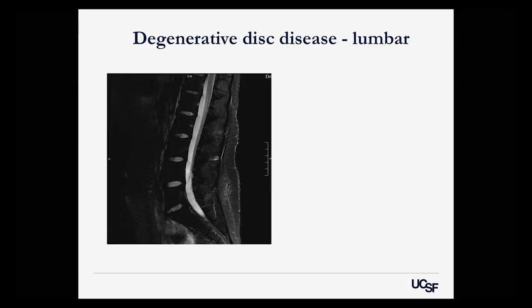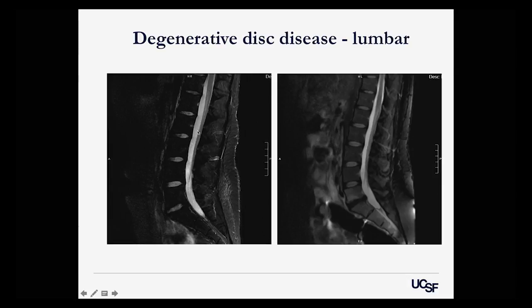This is an MRI scan that demonstrates some of the structures that Dr. Shah showed us. This is a sagittal MRI scan, so looking at a patient from the side, these are the discs. The bright coloration means that they're well hydrated because they're supposed to be the cushions between the bones of the spine. What immediately jumps out from this second image is at the very bottom. This disc has lost some of that bright coloration, so it's become dehydrated. This is a degenerative disc disease, and this can actually be very painful. All of the images I show here are patients that I've treated.